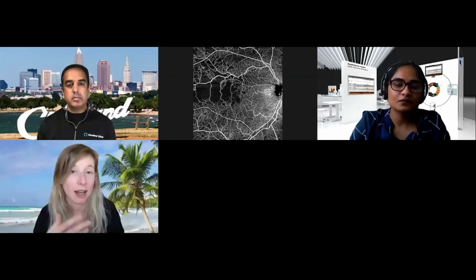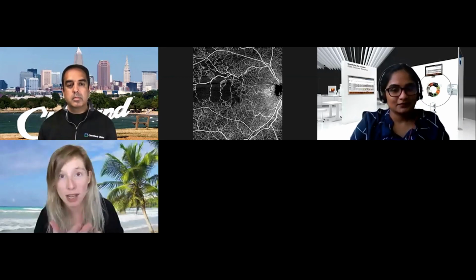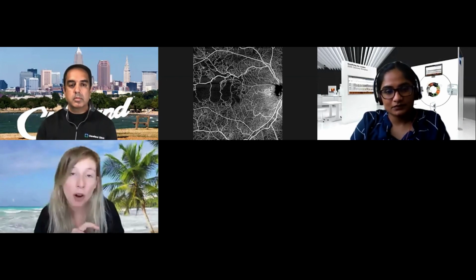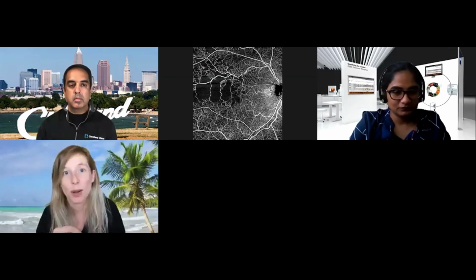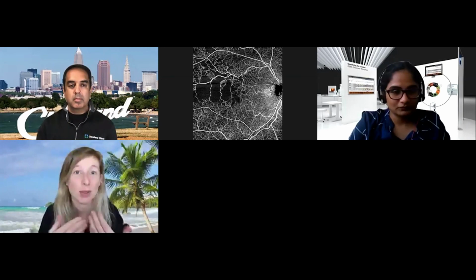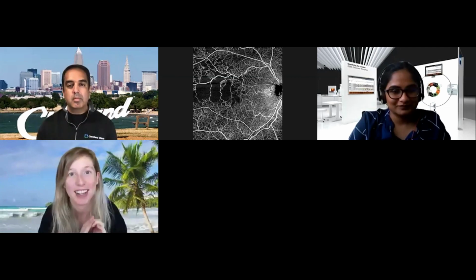And I think most retina specialists use some form of a treat and extend protocol for macular degeneration. That's one of the harder things to taper and know exactly how they're responding, how that extension is going. So I'm very interested in how that OCTA research will go with time. I think that's a really cool area, but especially the geographic area as well. That's really, I hadn't seen that yet.